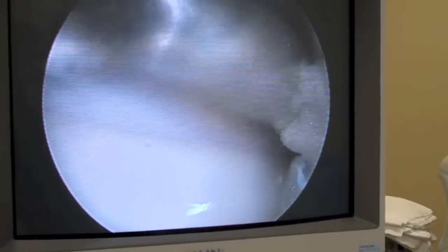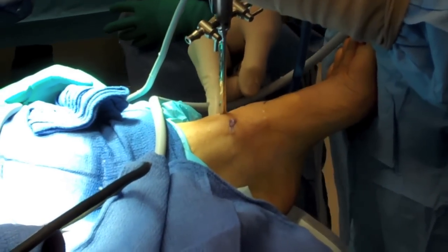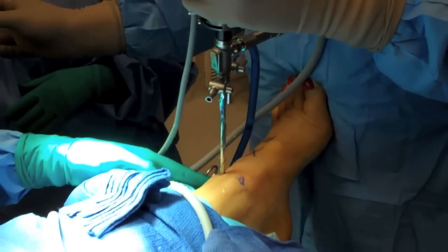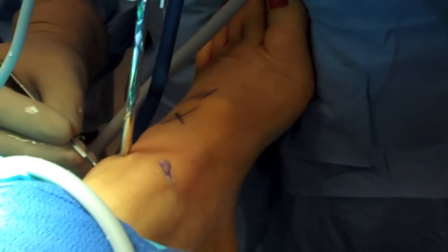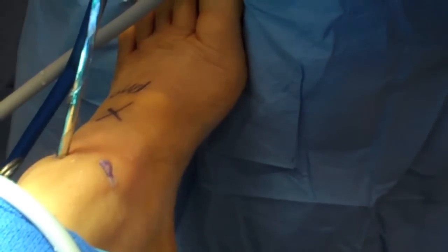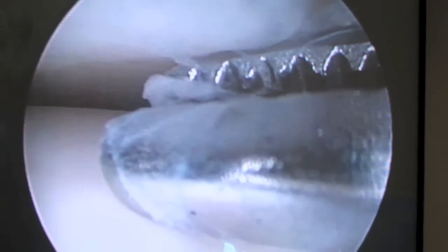It is also important that you are careful when shaving not to hit the camera lens with the shaver as it will scratch it. Here I am utilizing transillumination to isolate my anterior lateral portal. I am palpating this area under direct visualization. I can see this indentation arthroscopically. I am going to make a small stab incision over this area and bluntly dissect into the joint, then utilize a blunt tipped obturator to enter the joint and shave the lateral portion of the joint under arthroscopic visualization.